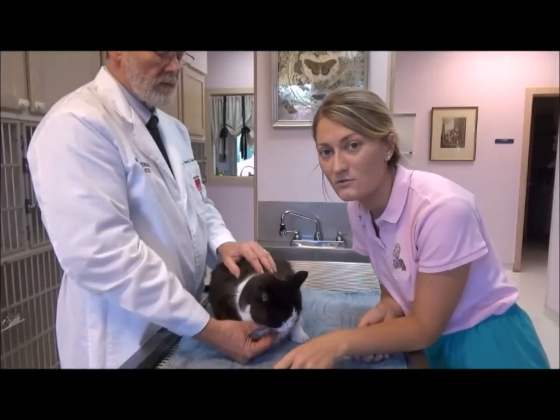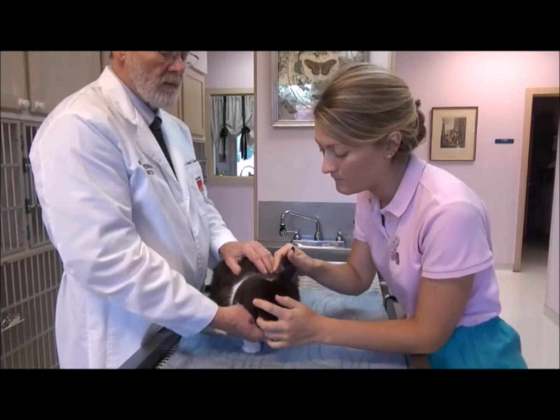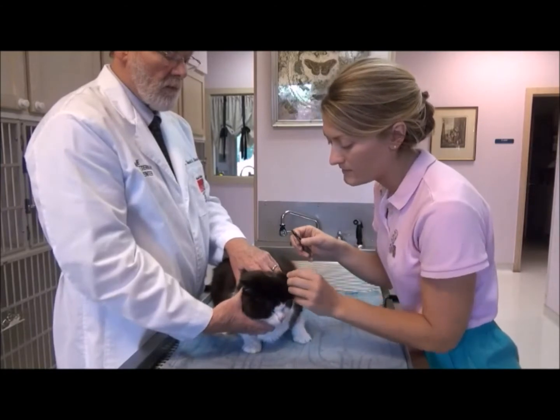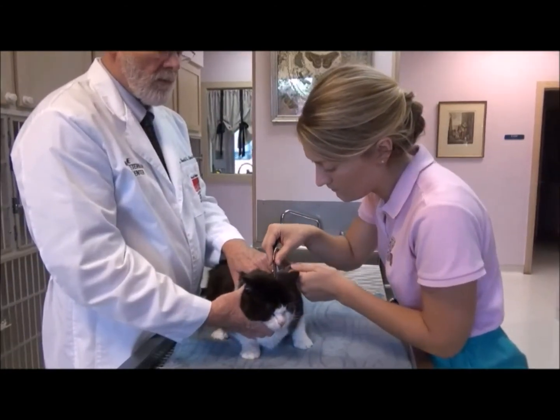We performed a tissue punch biopsy on Chance. He had a small growth on the top of his head. So we placed one staple in. So it's ready to come out. So I'm going to go ahead and remove that now.